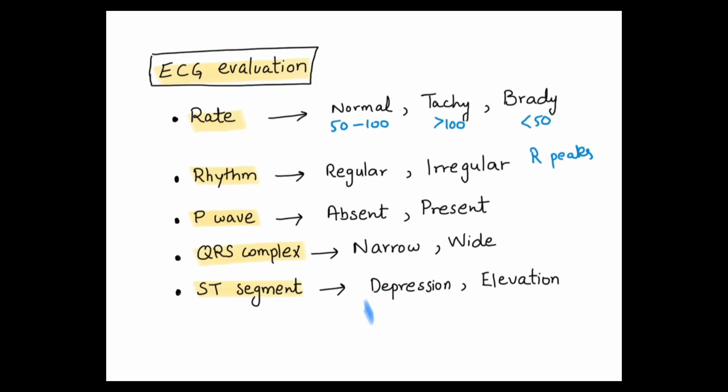And there are some very famous terms that you must have heard, like NSTEMI and STEMI, like non-ST elevation MI and ST elevation MI as well. So these are just basic terms that you should know. Let's move on to each step one by one.